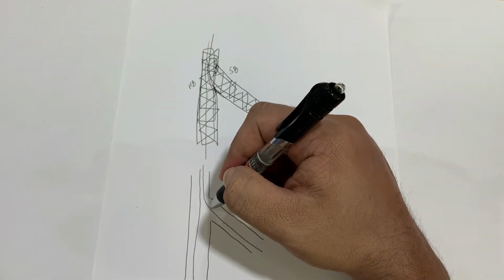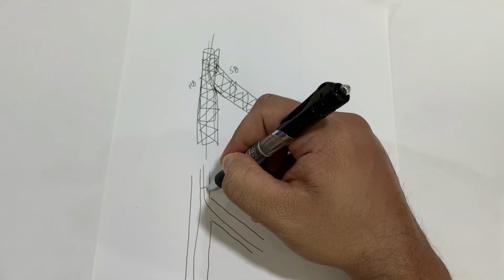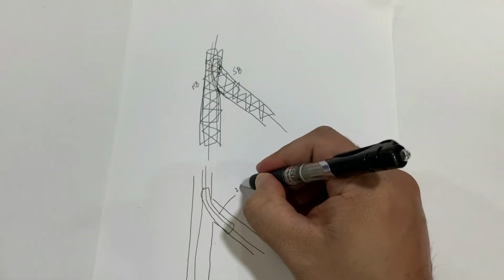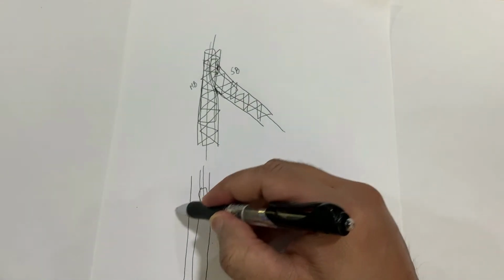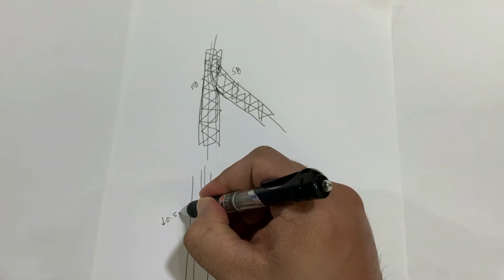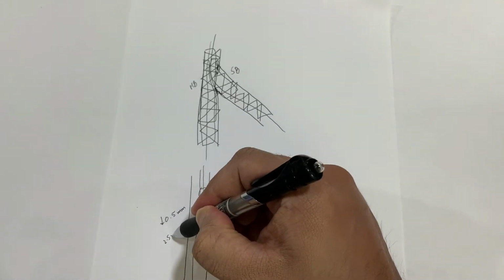What I do is I usually use the same size as that of the side branch for the side branch balloon. So if it is a 2.5 millimeter vessel, I use the 2.5 millimeter balloon. For the main branch, I decrease it by 0.5 millimeter. So if it is a 3.0 vessel, I use a 2.5 millimeter balloon.